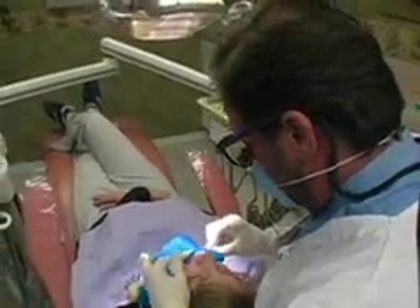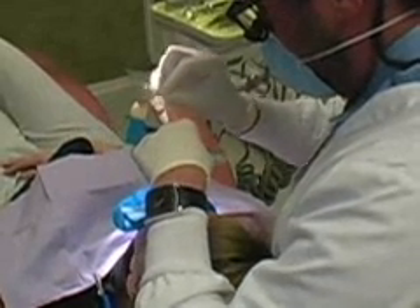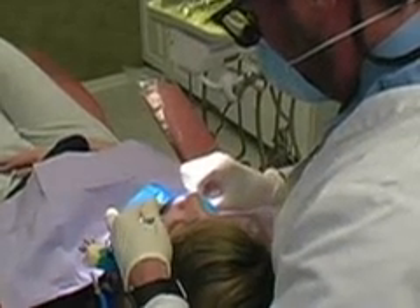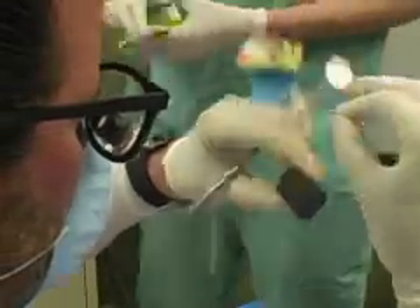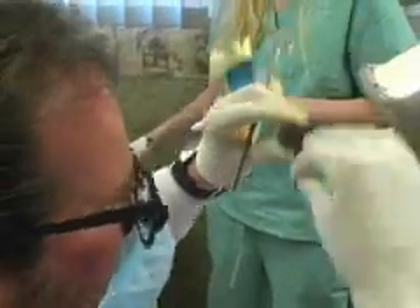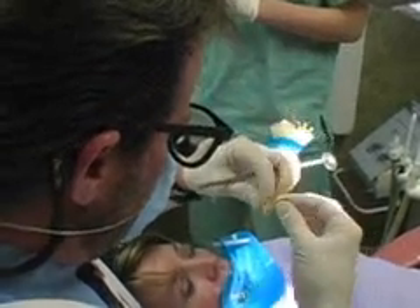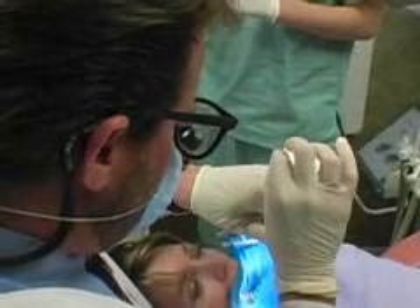Once we open the tooth up, we use small files, which I'm using here. What that does is it both measures the lengths of the tooth's roots and also shapes the tooth and removes the infection inside the tooth root. That's why she needed root canal — she has an infected tooth. We're shaping the tooth with our files and measuring them as well. I use the X-ray to give me one approximation of how long the tooth roots are, but we also use a machine called an apex locator to help us as well.